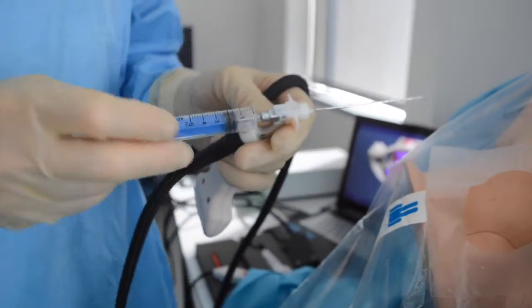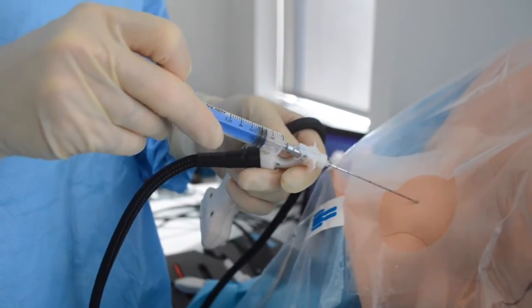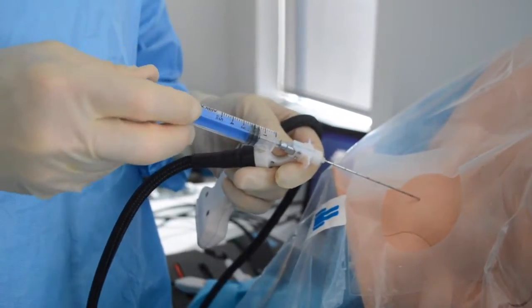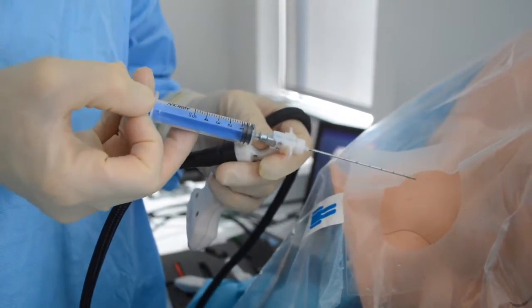In addition, because during vascular access you essentially want to draw blood from a vessel, this will influence the way you hold the syringe. You want to hold the syringe in a way that you are able to put traction on the plunger.